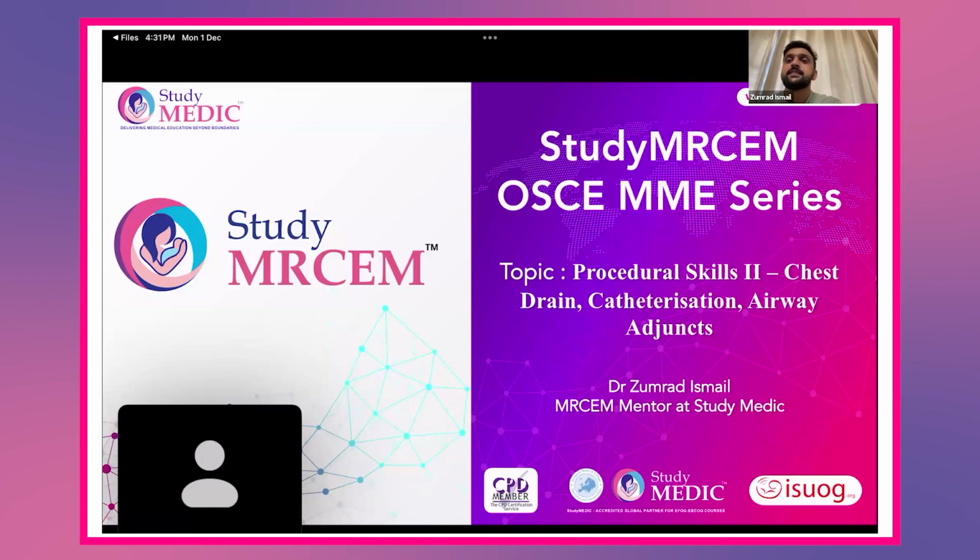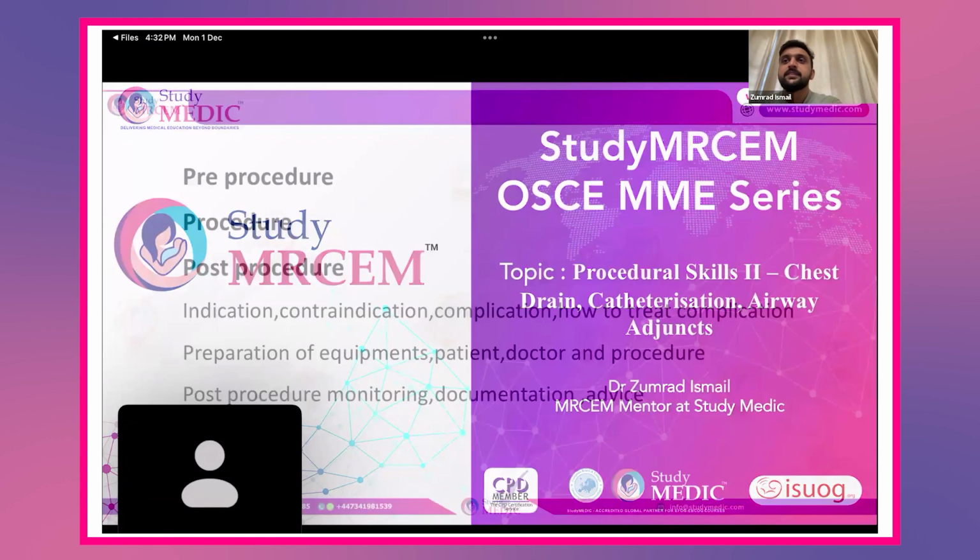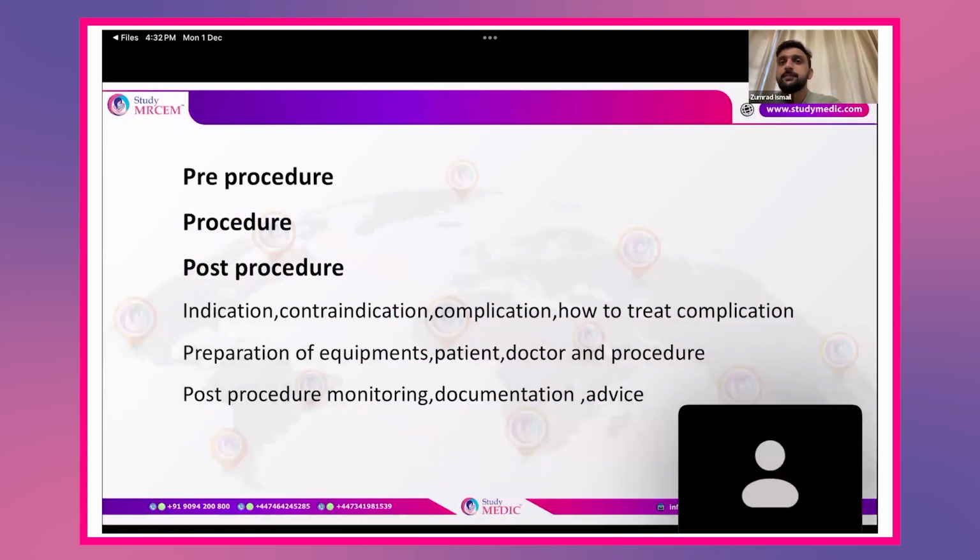Today we'll be discussing chest drain catheterization and airway adjuncts. First we'll start with what the procedure will be. In every procedure station, we'll divide the station into three: pre-procedure, procedure, and post-procedure. In the pre-procedure, we will explain indications, contraindications, complications, and how to treat the complications.